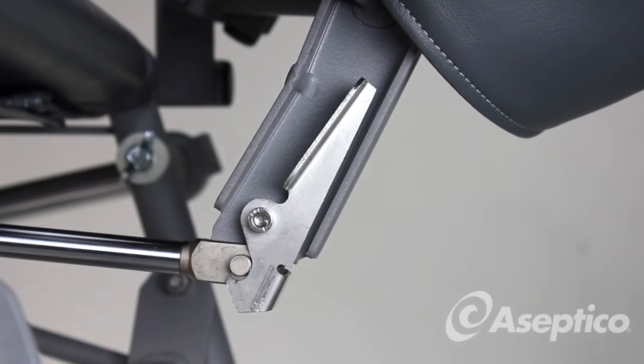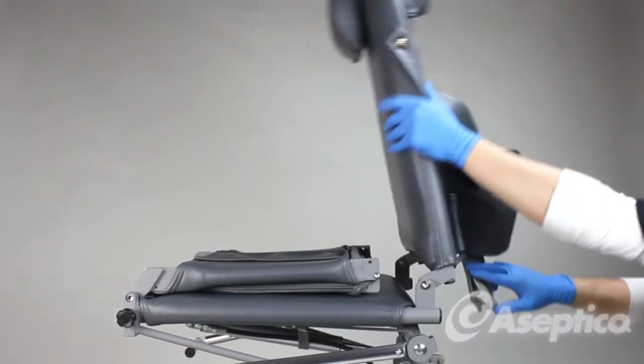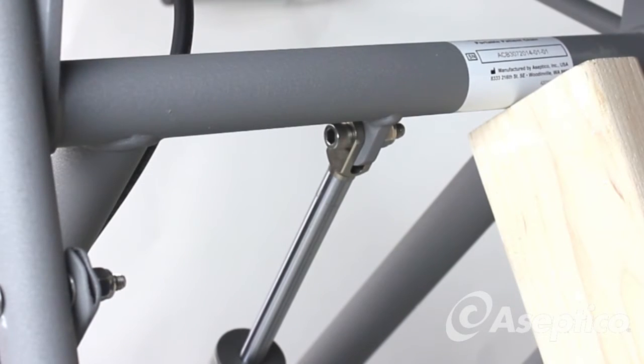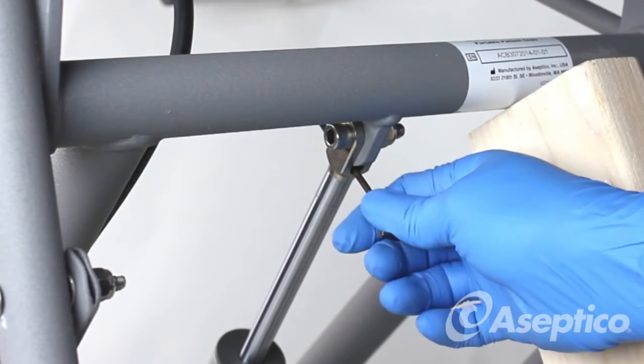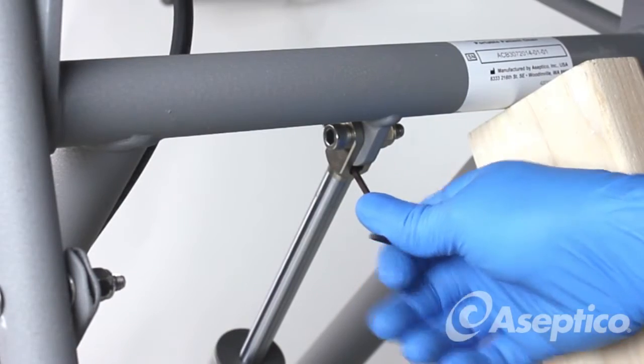Unlatch the backrest cylinder, push the lever in, and then push down. To relieve pressure from the seat cylinder, stick an Allen wrench in, push down on the foot lever, and push down.